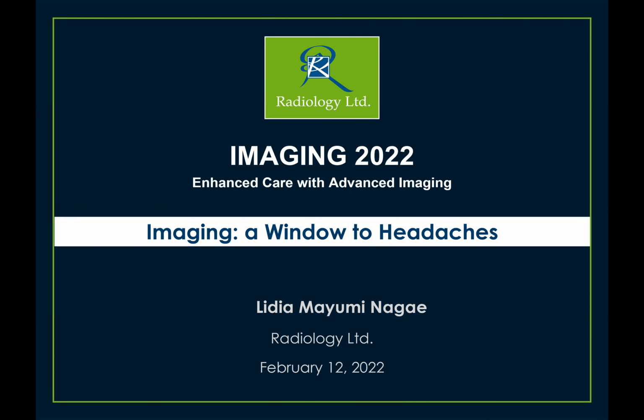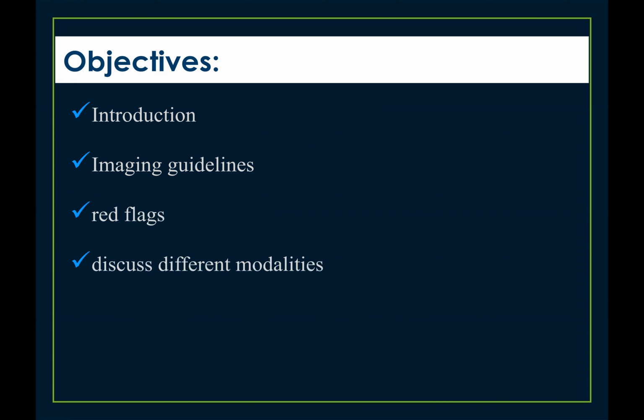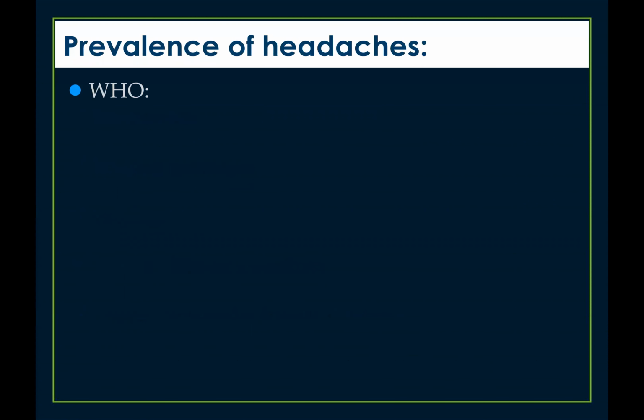I'm one of the neuroradiologists at Radiology Limited, and it's my pleasure today to talk to you about imaging for headaches. Following a brief introduction, we're going to go over the imaging guidelines for headaches, highlight some red flags, discuss different imaging modalities, show some common incidental findings, and review some specific headache syndromes and best imaging approaches.